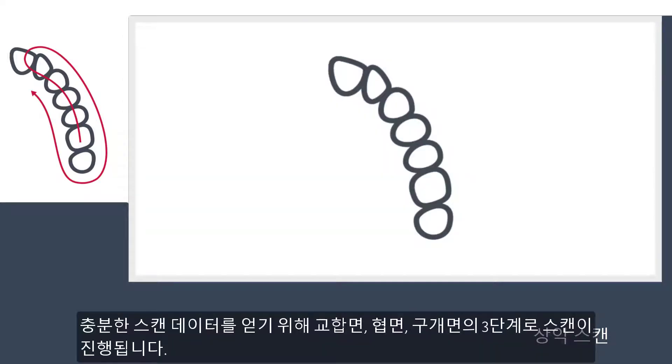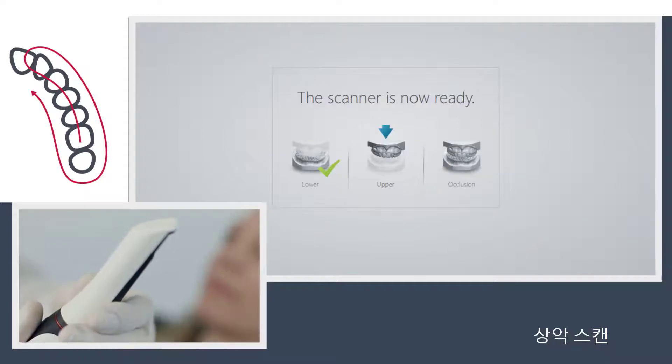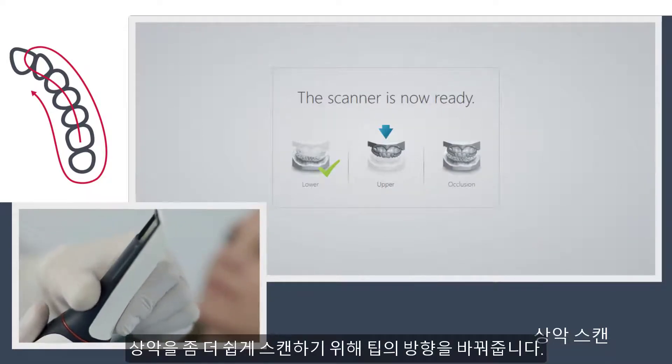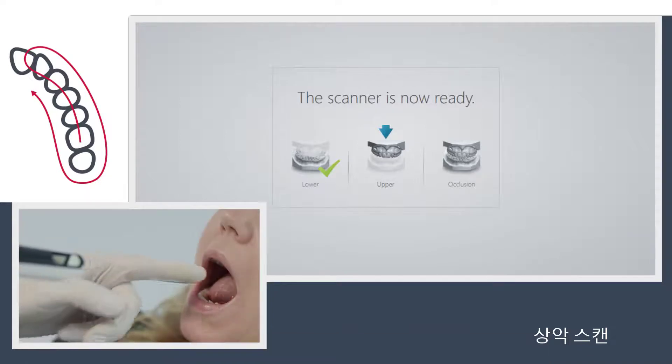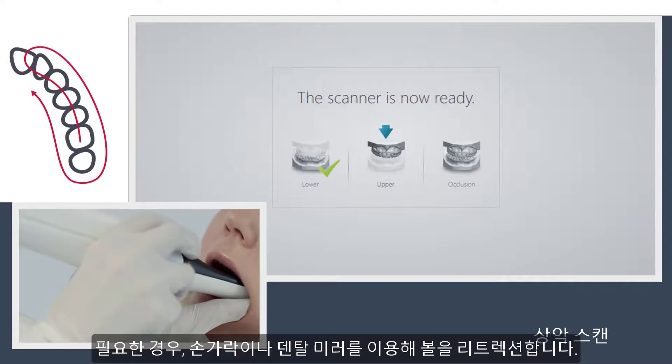The recommended scanning path for the upper arch consists of three swipes — occlusal, buccal and palatal — to ensure good data coverage of all surfaces. As an option, you can choose to turn the tip up for easier upper arch scanning. Use your finger or a dental mirror to create space between the teeth, lips and cheeks if necessary.